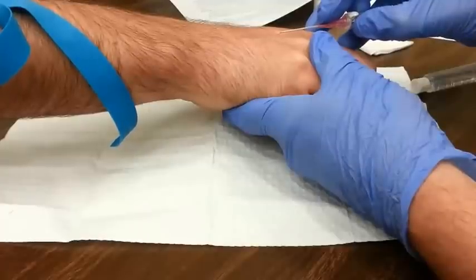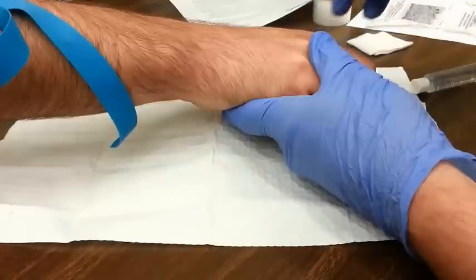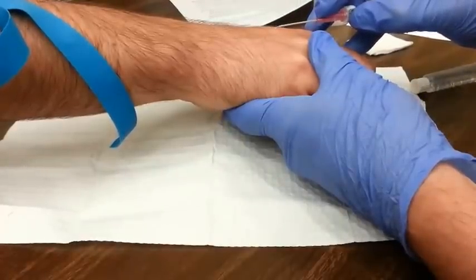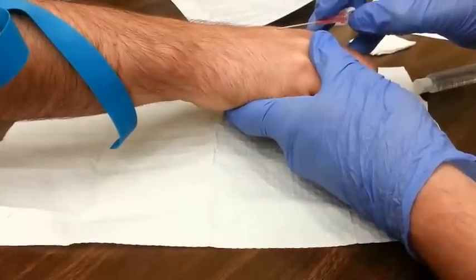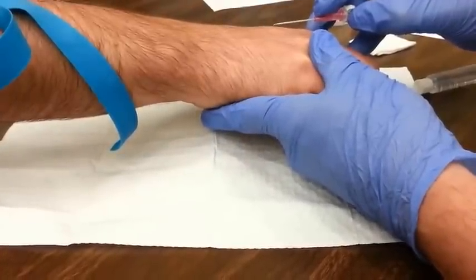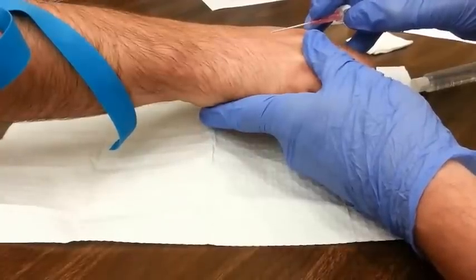The next trick is to figure out an angle. You don't want to stick the needle in the arm at a 45 degree angle because we are not digging for gold, we are digging for a vein. This could be very dangerous to the tissues underneath the vein if you have it at too extreme of an angle. Veins are pretty superficial so it won't take long before you encounter one. I typically hold the needle at a 15 to 20 degree angle. Make sure you insert the needle in a nice and controlled fashion.